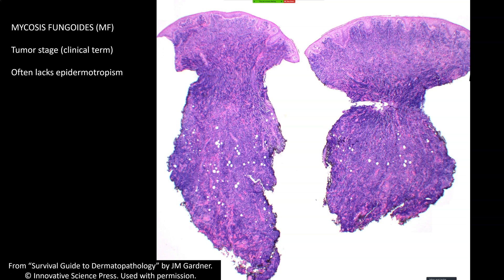I could not look at this biopsy without clinical information and know it's MF. From low power I can say this is almost certainly a lymphoma — the dermis is completely replaced by blue cells, which goes well with lymphoma — but I can't say it's MF specifically. There's a clean line between the epidermis and dermis, no epidermotropism. Without knowing the patient has known MF and now developed nodules, I could say T-cell lymphoma but not confirm MF. Unless I know the patient has patches and plaques on sun-protected areas like the buttocks and trunk, I'd have to correlate clinically.